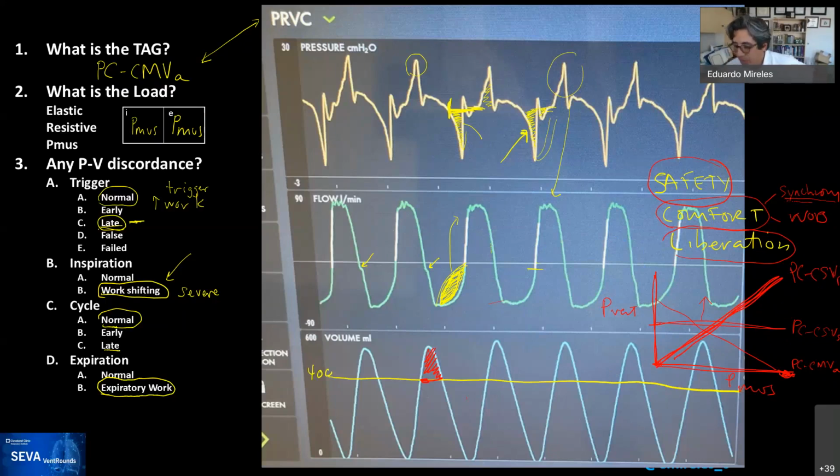All righty. Udi, great job. Very nice comments from the audience. I think that we learned a lot. Just this waveform is a stop-and-take-care-of-me waveform. Any other comments?